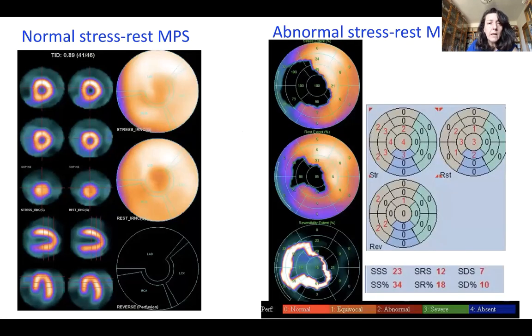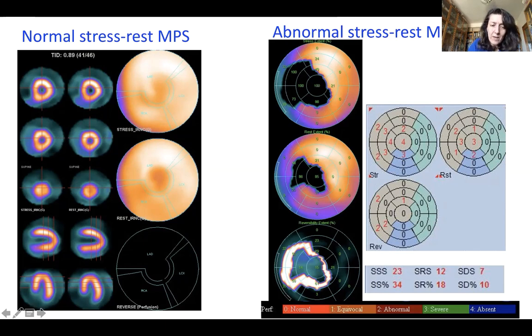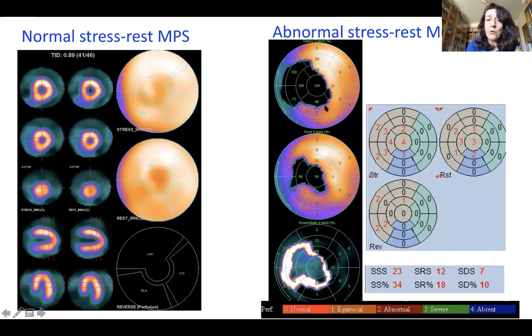For the normal stress scan, you can see stress, rest, and the difference between stress and rest — showing no difference in tracer uptake. You can also evaluate vascular territories: LAD, RCA, and LCX. To better understand semi-quantitative analysis, it is useful to examine an abnormal stress scan.